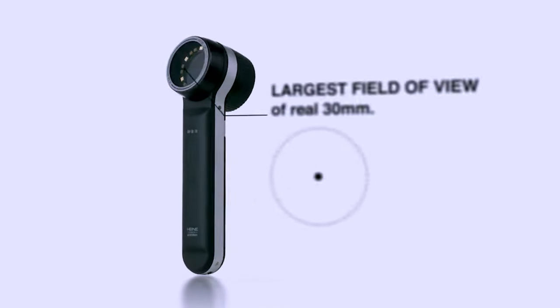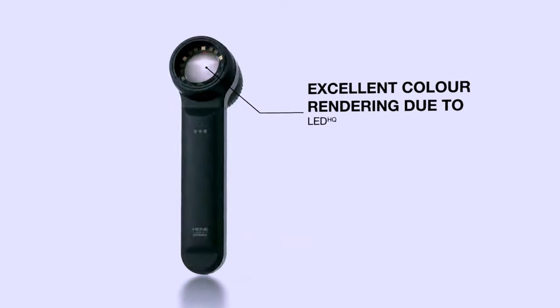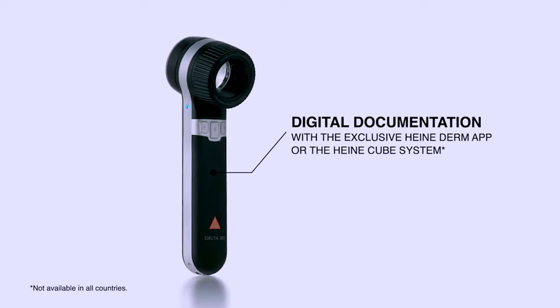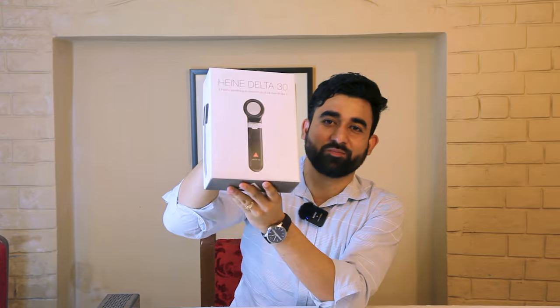Hello ladies and gentlemen, we are back again with a new video. You are watching Surgical Shop and I am Abhishek. Today I'm going to show you the Heine Delta 30 dermatoscope. Let's see some of its highlights. This is the first look of the Heine Delta 30 dermatoscope.